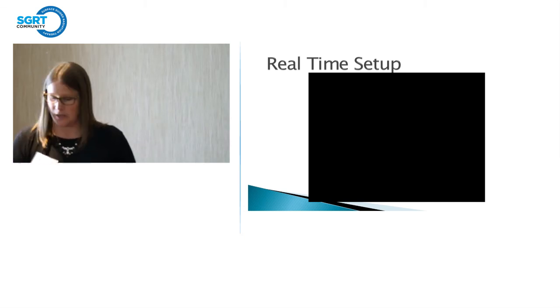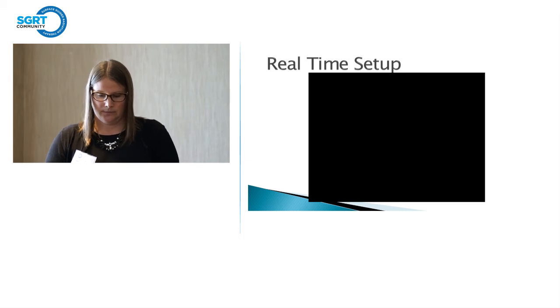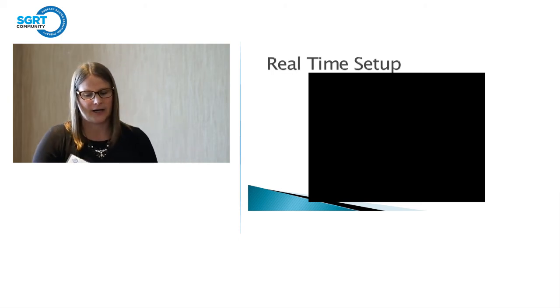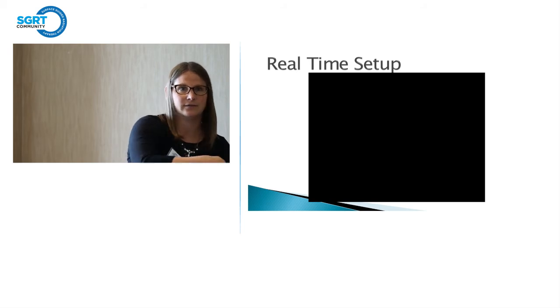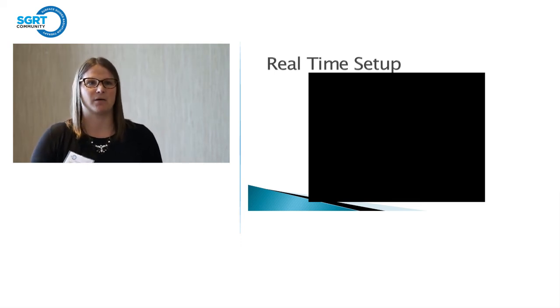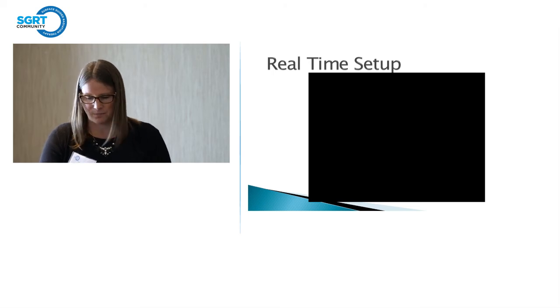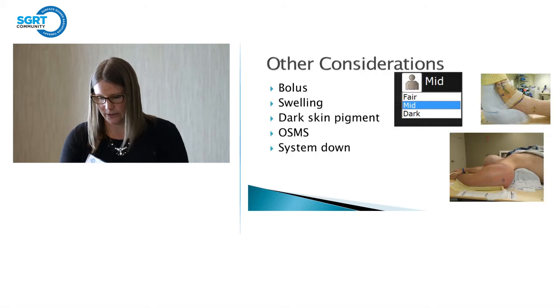Once we turn it on, which will happen momentarily. I was filming as they were setting the patient up. My editing skills aren't great. You can see that lateral outlier is almost 3 millimeters. The therapist accidentally moves it in the wrong direction. You saw it go red and then come back. They'll adjust for that. She's feet to gantry, so she was initially probably thinking it needed to go one way. That's why it went into the red for a second, but it's very reliable, as you can see here. That's all green and good.